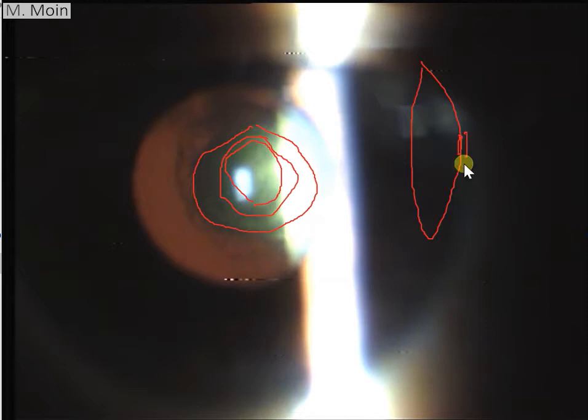And when you're doing surgery typically when you're doing hydro dissection in this area what will happen is this is an area of weakness and this is an area of nucleus sclerosis and if it usually when they develop into a white mature cataract that is when the disaster happens.